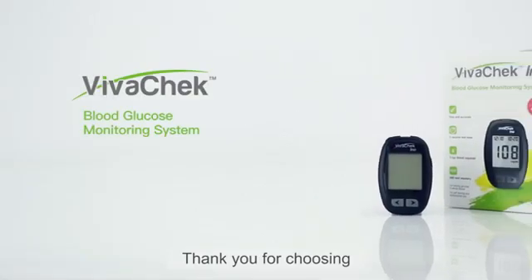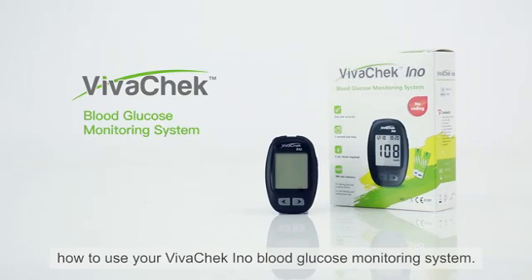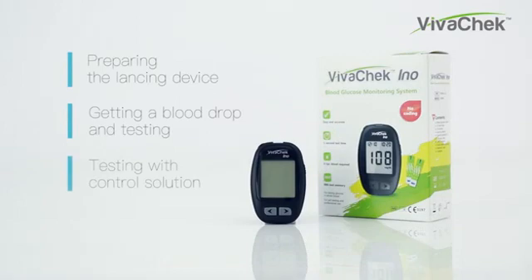Thank you for choosing VivaChek Ino Blood Glucose Monitoring System. This video will show you how to use your VivaChek Ino Blood Glucose Monitoring System. The video is divided into three parts: preparing the lancing device, getting the blood drop and testing, and testing with control solution.